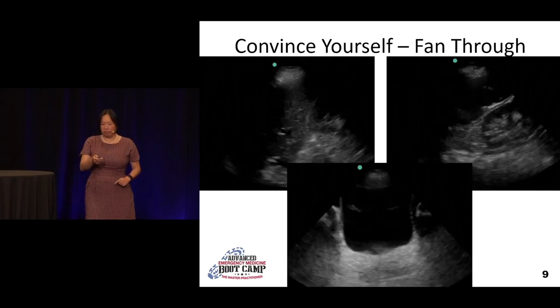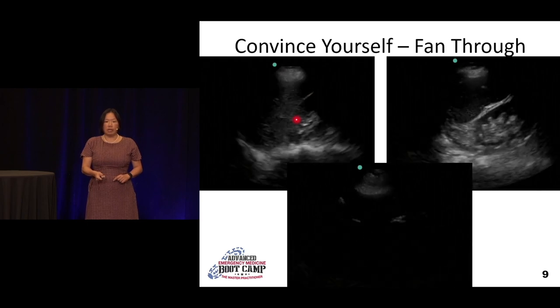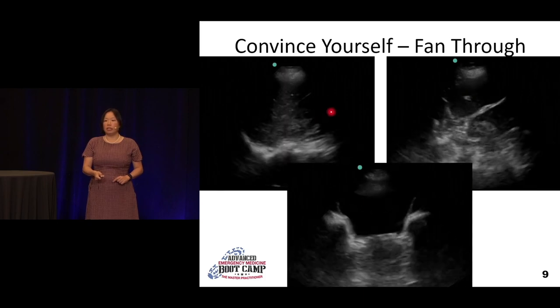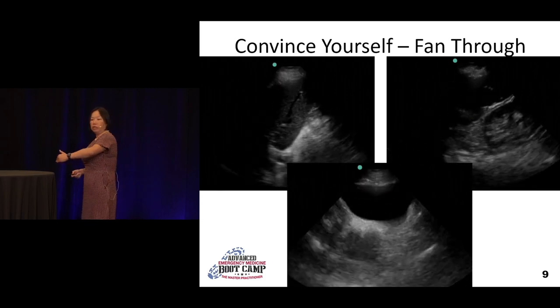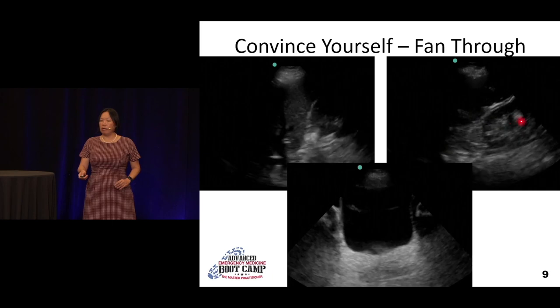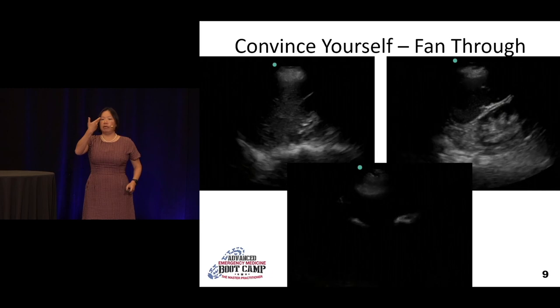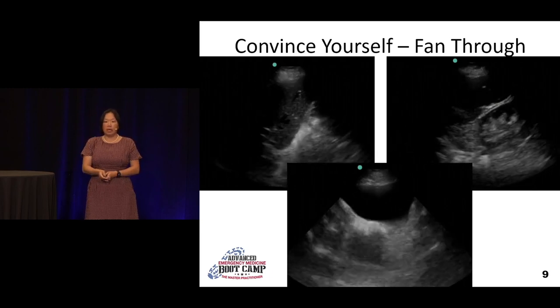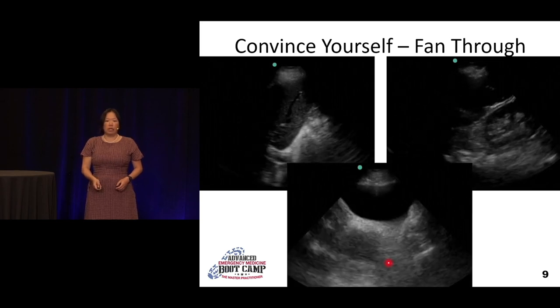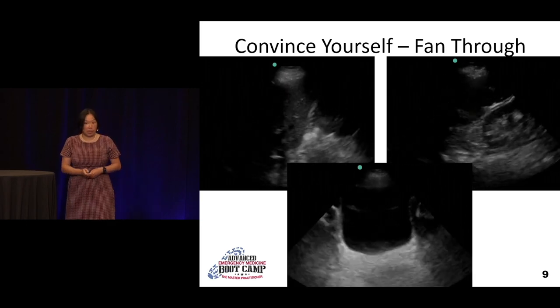Here are some pictures of the fanning. Here is the liver, here's the kidney — and as you fan through, you're looking until the kidney disappears. You're fanning anteriorly toward the front of the belly, then fanning posteriorly. Same thing on the left side. And in the bladder view, you fan superiorly toward the head and inferiorly toward the feet, so you're going to see the prostate or uterus come in and out as you're scanning through the entire space.